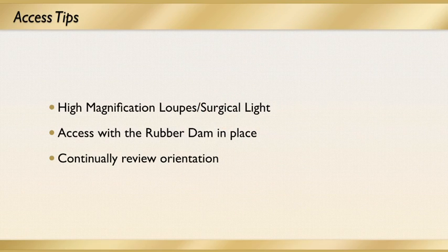Now, when you start your access, you're going to go slow. It's going to be small bites. You're going to continually stop and review your orientation. As you're drilling into the tooth, you're going to make sure that you have the burr at the correct orientation.